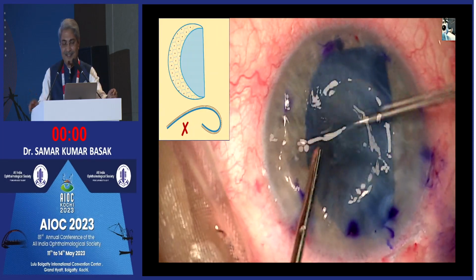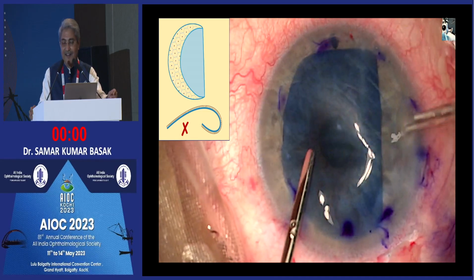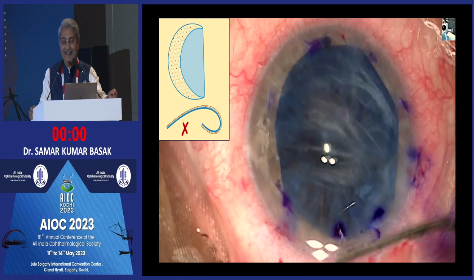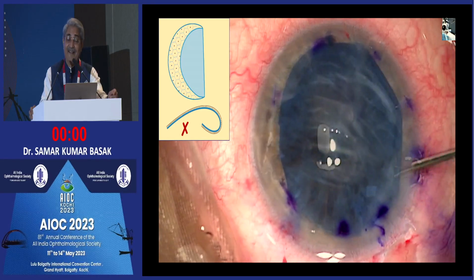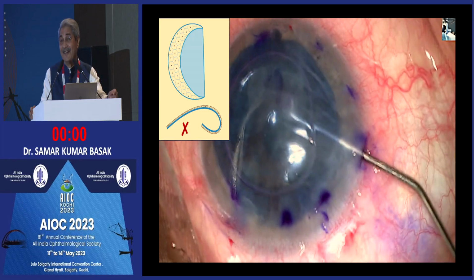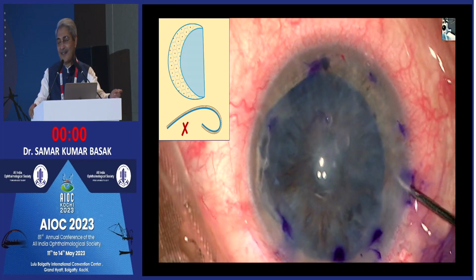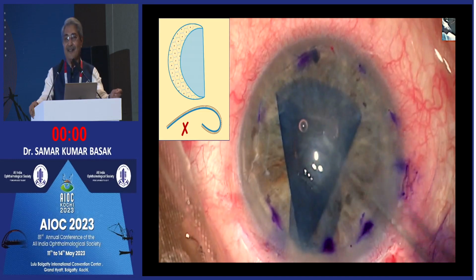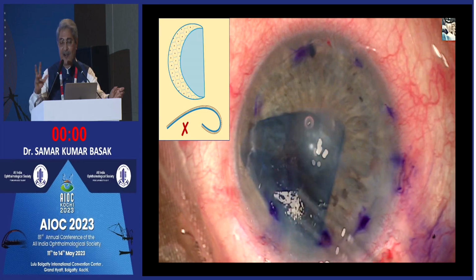This was something I showed in a live surgery in Italy, and everyone was saying, yes, you are right. But then I put air, and you see that the S was reverse. So this happened. Rajesh was the panelist in that. I was operating in Kolkata. The video was shown in Italy. And you see that after, this is like an origami type of picture.